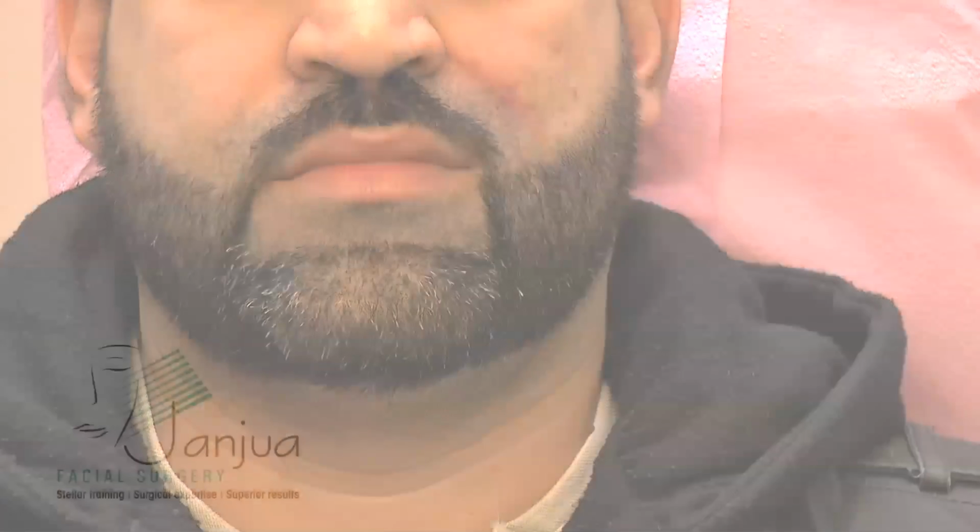The goal is to just minimize any hypertrophy or atrophy, and that's where a fractional laser such as Resurfax works very well. And once we are done with that issue, then at some point, if erythema, the redness persists, then we can use IPL, or we can use a vascular beam laser to control that redness. But right now we are on track.